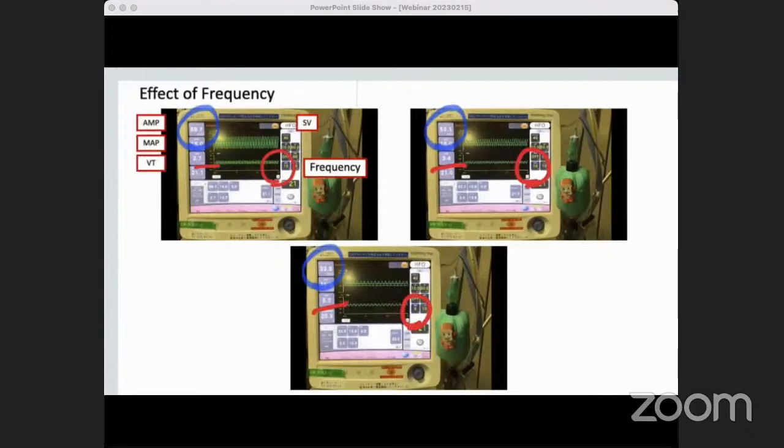If the power produced by the ventilator is limited, it is easier to control the tidal volume by reducing the frequency. This is the reason why reducing frequency is recommended to adjust the tidal volume. The ventilator power is basically the difference why patients can be managed at 15 Hz with the Humming, while with VN 500 you will need to use 10 to 12 Hz instead.